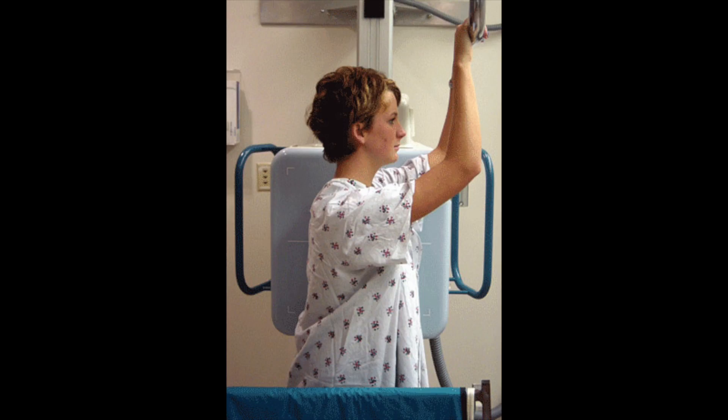In the case of the lateral view, you do want the patient on his left side against the cassette for the same reason. The x-ray enters this way, comes out this way, the heart is closest to the film, and thus there is less distortion or magnification effect.